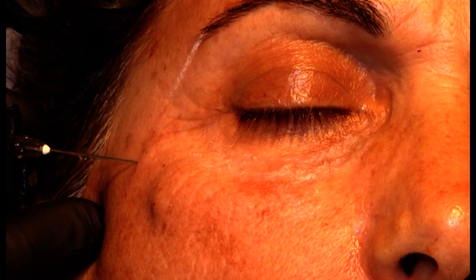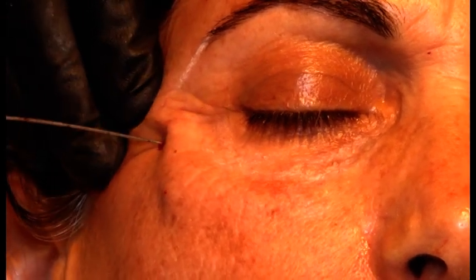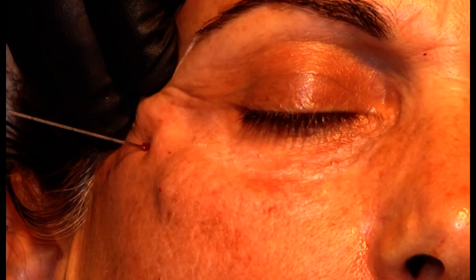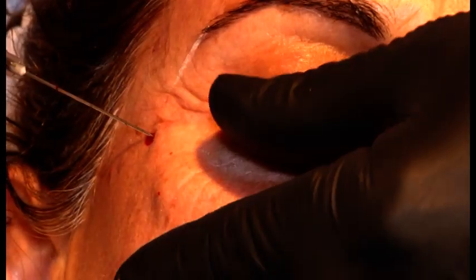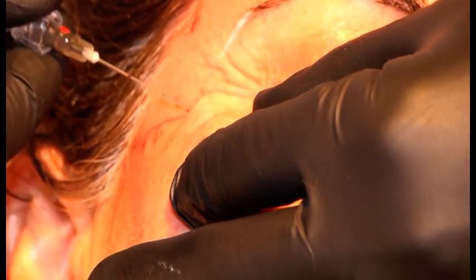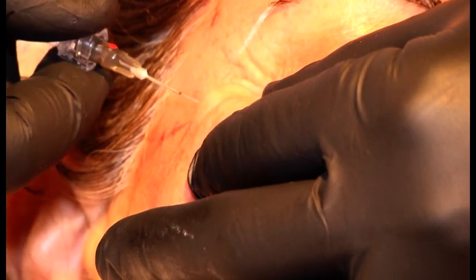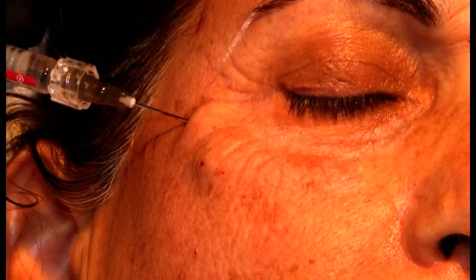Okay, palpebromalar groove. So I will go from the lateral part to the medial part, through the muscle. So I will lift up the tissue in front of the cannula, advance the cannula until I get to periosteum. Okay.